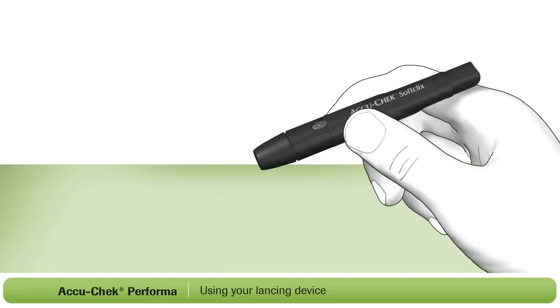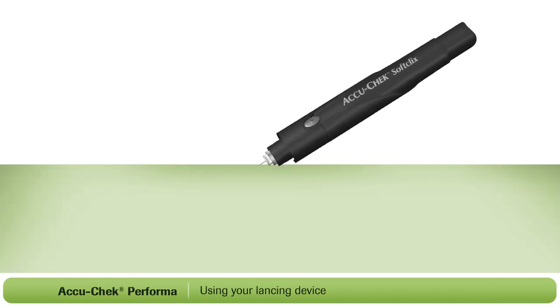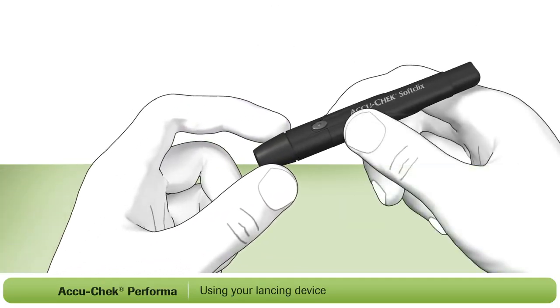To dispose of the lancet, remove the cap from the lancing device. To remove the used lancet, point the lancing device into the sharps container and eject the lancet by sliding the ejector forward as shown. Then place the cap back on the lancing device.